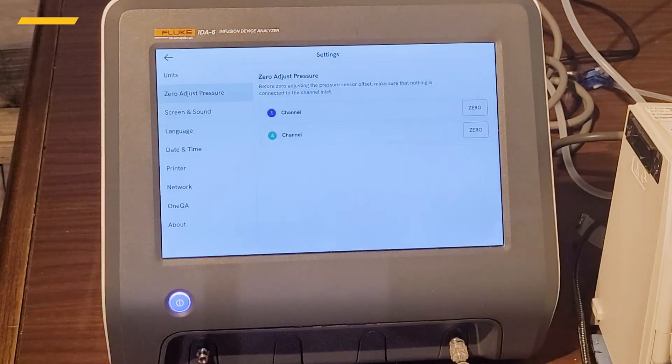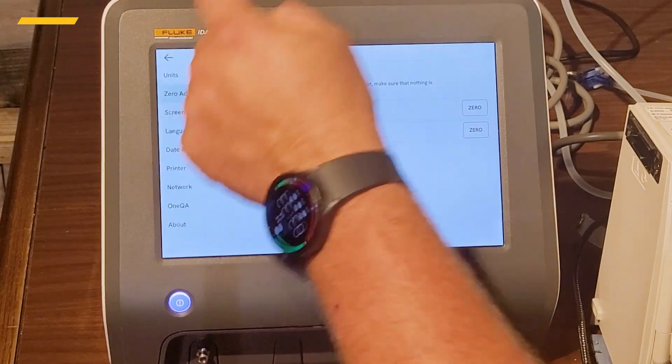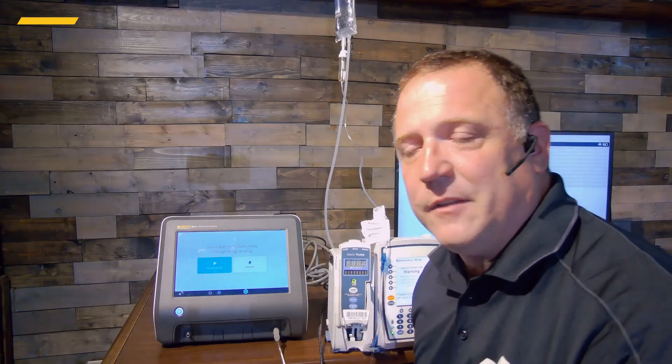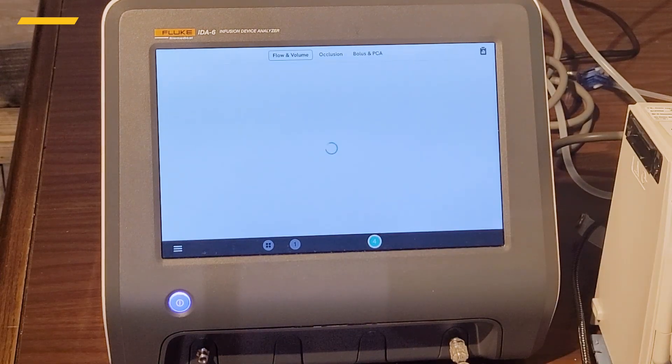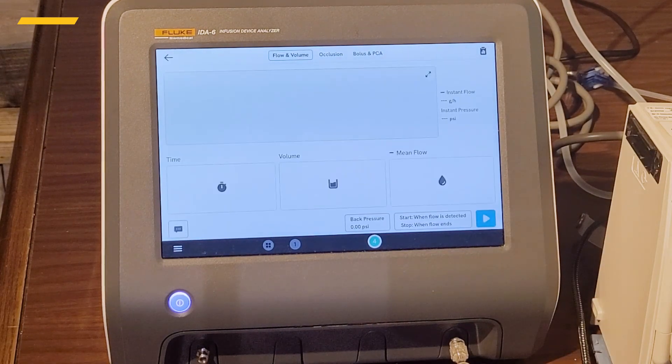Since we're in channel four, let's get channel four zeroed out and go back to our main screen. We're not going to use the workflow automation — we're going to use this in manual mode because we have to use Alaris's software. So let's pick Measure.